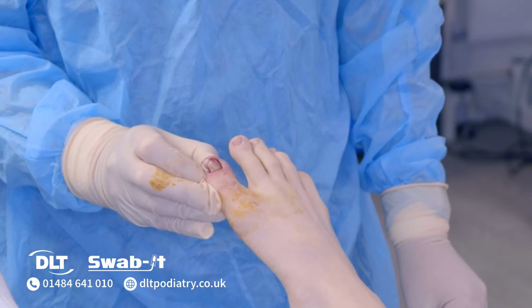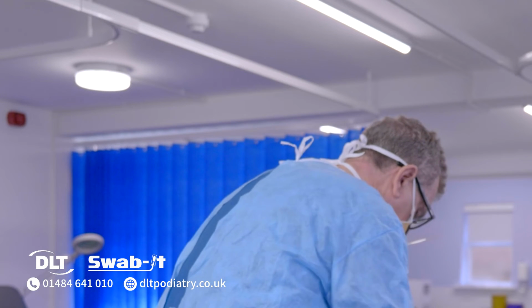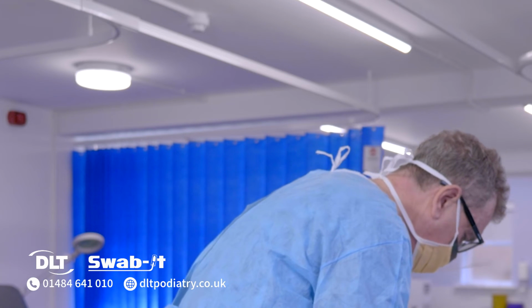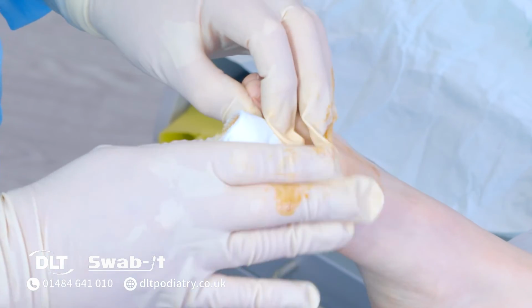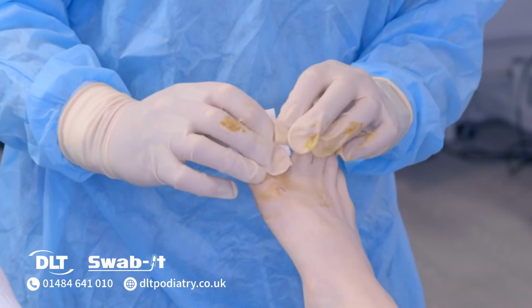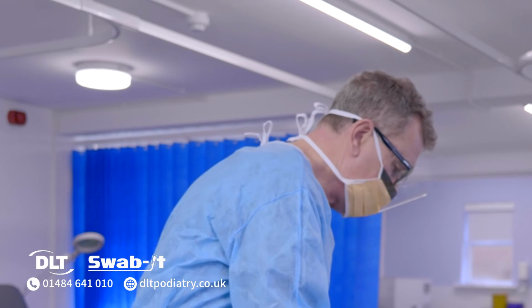So you can see he's coagulated really quickly. So for today, we're going to use some iodine gauze for the first dressing, covered over with Melolin, shiny side to the gauze, and then some swabs over the top. Have you got any Mefix? Hey, you got that? Yeah, thank you.